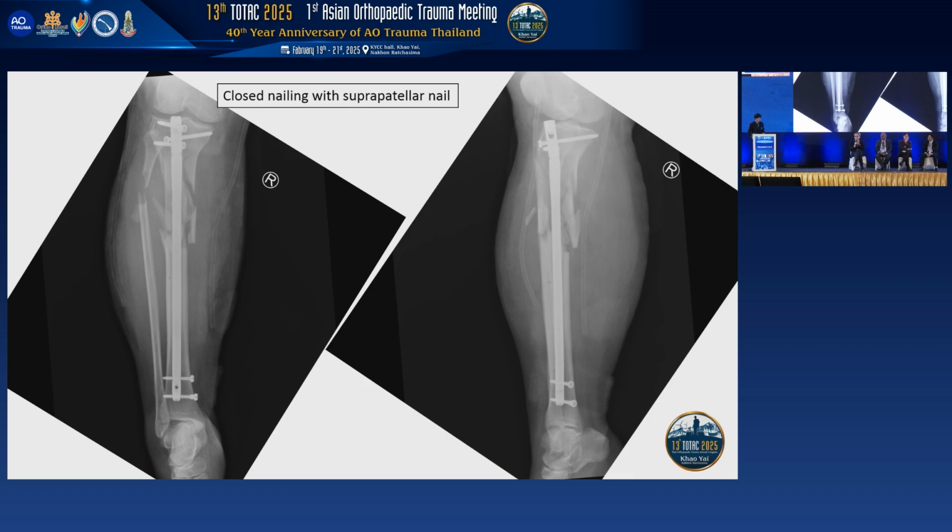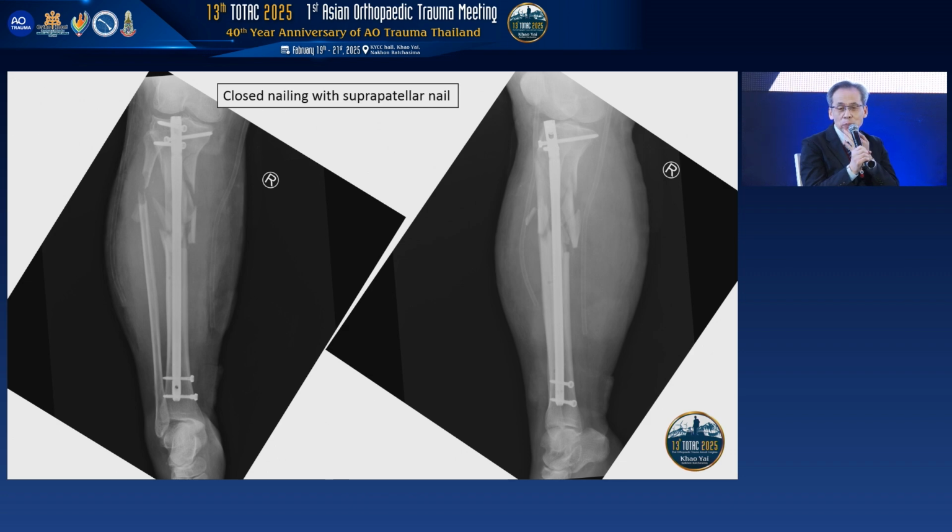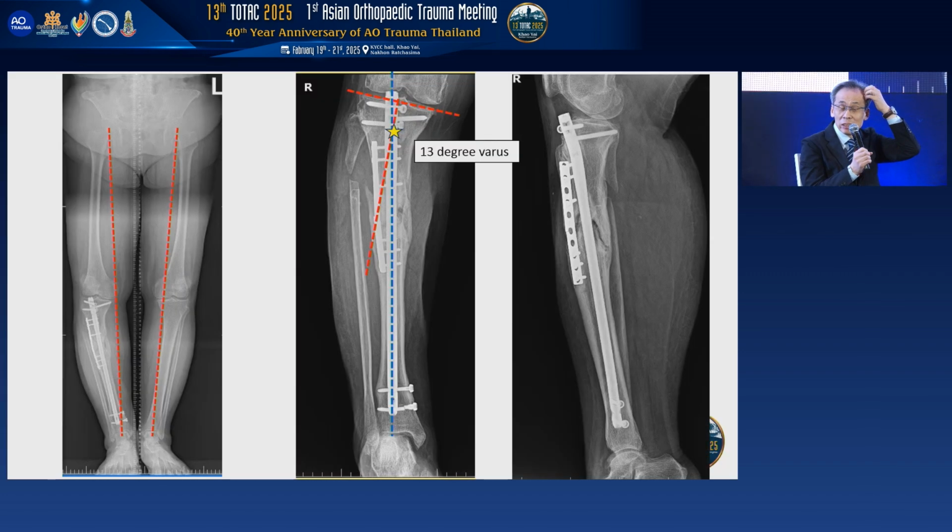Yeah, it's the same opinion. The fracture made this malunion, non-union. Although you made another line, another CORA in the proximal, I don't think it is really needed to make another osteotomy. We can use the non-union site. Probably there is some fibrous union. We need to make a complete fracture over there. And I may use Schanz pins parallel to the knee joint and parallel to the ankle joint. That's our guideline. As well, I can use a femoral distractor to correct the deformity.